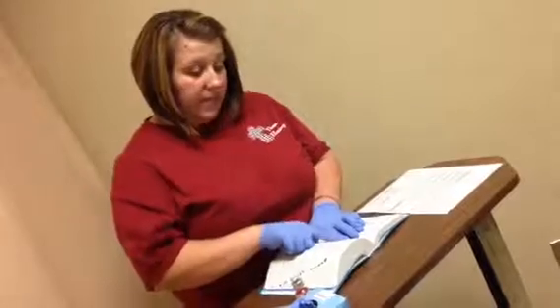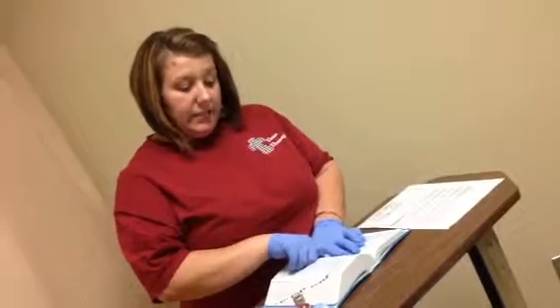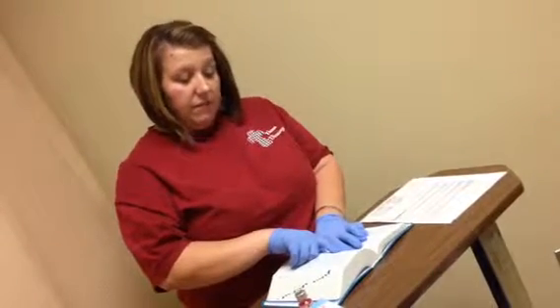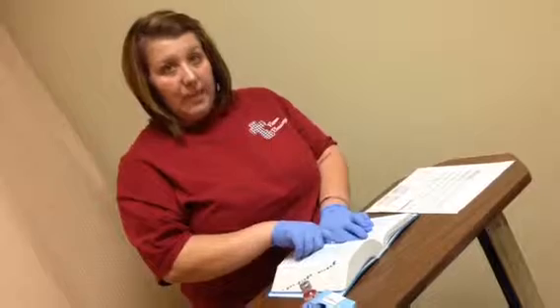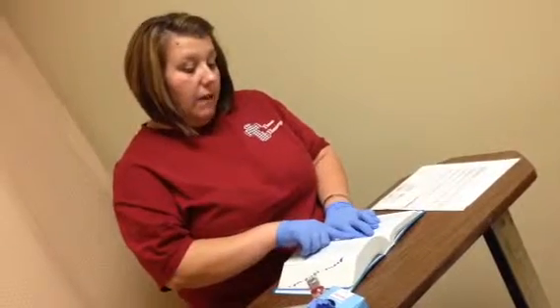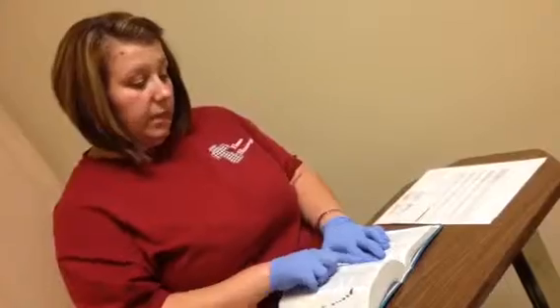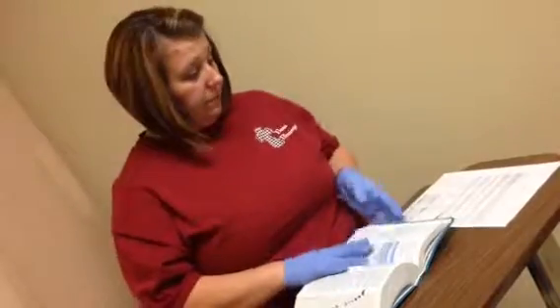I'm going to look up and see how much I need to dilute it with, okay? And my drug book says it needs to be diluted in at least 5 milliliters of normal saline. So I need to make sure I dilute it with at least that. I need to push this medication over 3 to 5 minutes, okay? So it tells me my push rate. It tells me how much to dilute with, okay? So I've got that information.